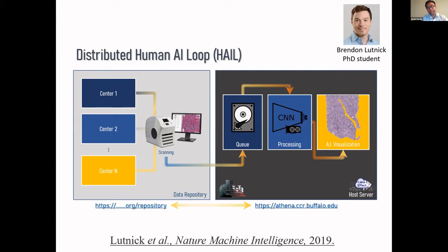But as we know, these histology images or histological staining of tissues go through several types of pre-analytic variations, including imaging, tissue preparation, tissue sectioning, staining, and so on and so forth. So if we try to deploy this tool on another person's data, or someone is trying to use their data with our tool, they may not get as accurate a segmentation as possible. And that's where this human interactability with the system comes into play. It also allows a human to be in control of an AI system toward auditability of the system.